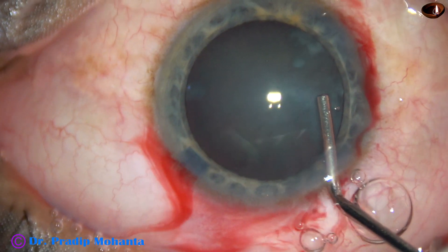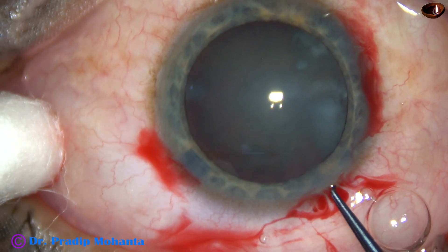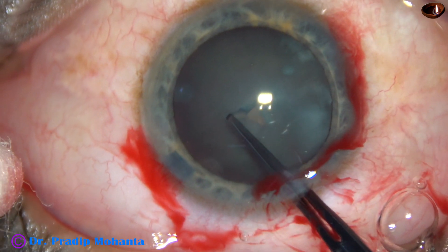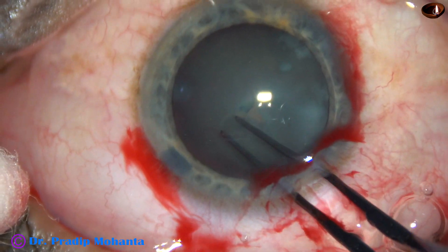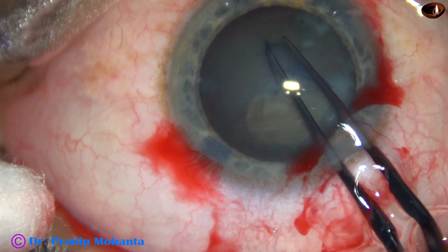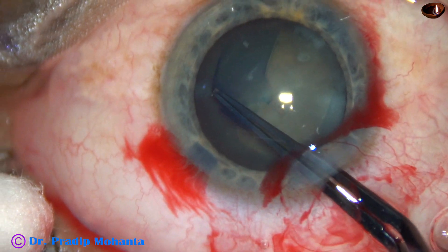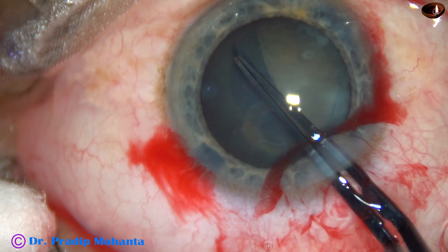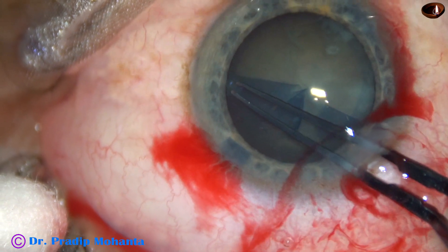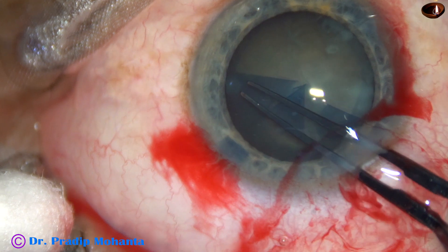The anterior chamber is filled up with this viscoelastic. Then a utrata forceps is taken. The tip of the utrata scratches the capsule and raises a capsular tag. Hold the capsular tag and guide it in such a way that we get a fairly round rhexis, remaining at a certain distance away from the margin of the pupil. But here, as I came to 3 o'clock, the capsule tends to go to the periphery.